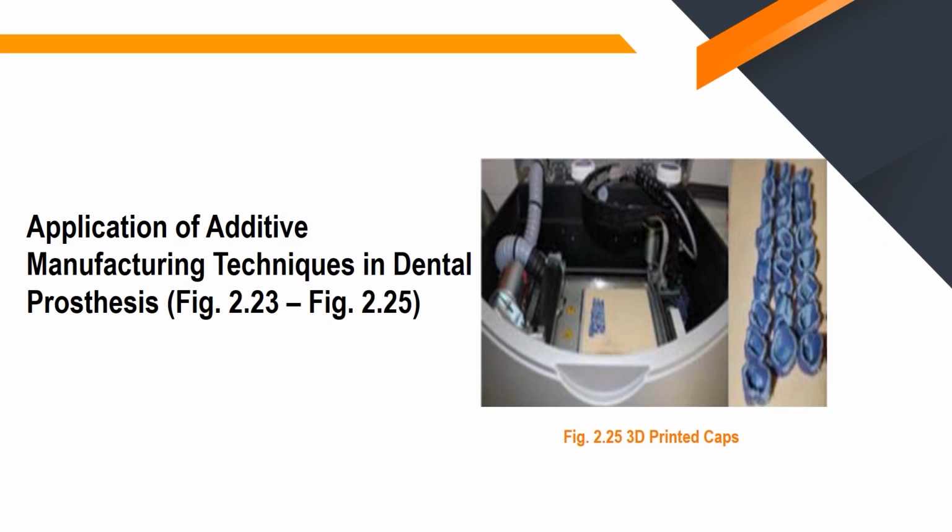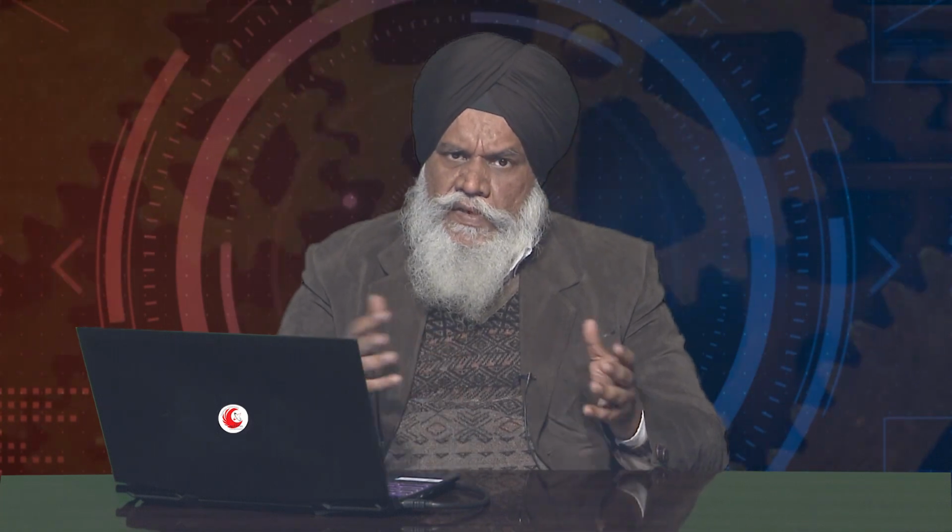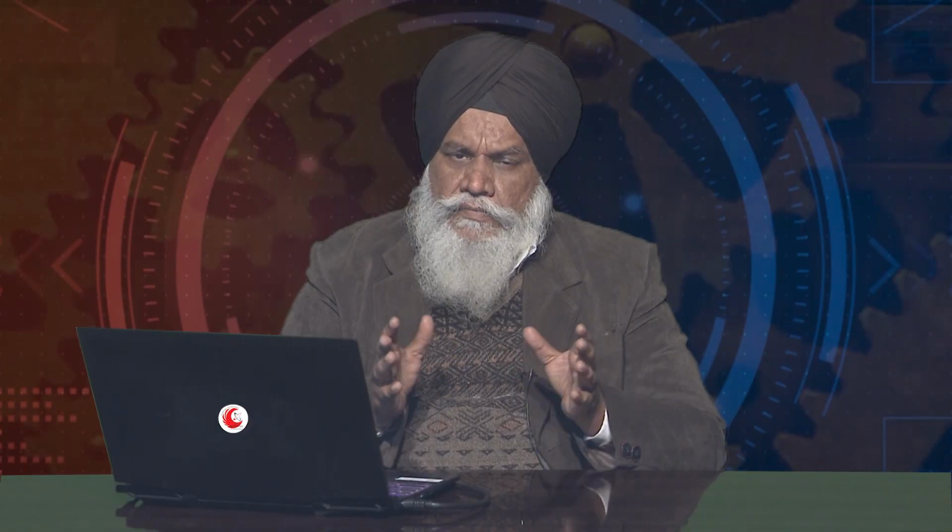Now, this polymer crown has actual application specifically in the case of sugar patients. Now, you see, if you have a larger database of sugar patients, specifically the old age patients, who are having a chronic level of sugar.